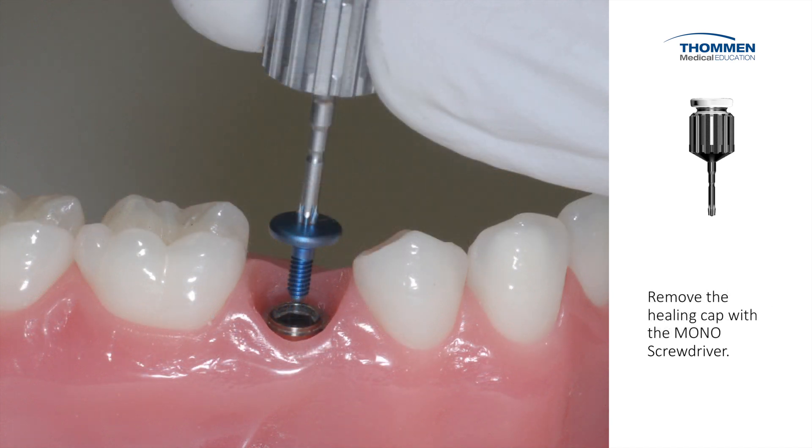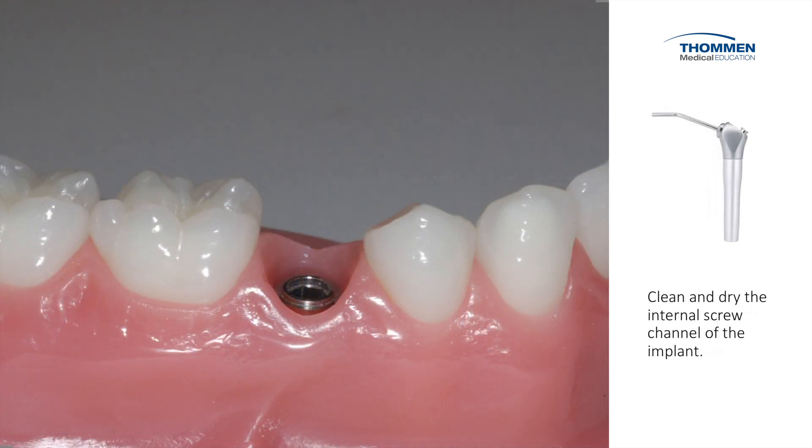The screw carrying ability of the monotorque driver allows us to lift the gingiva former up out of the implant. We then clean and dry the internal aspect of the screw channel with water and air.